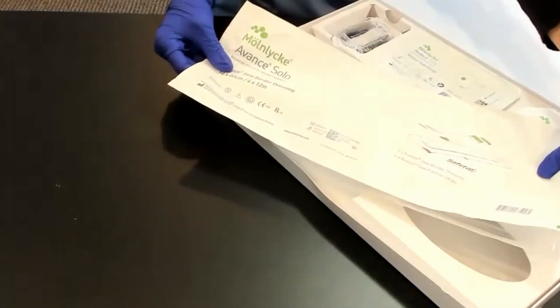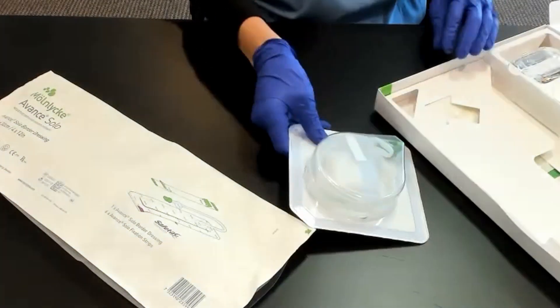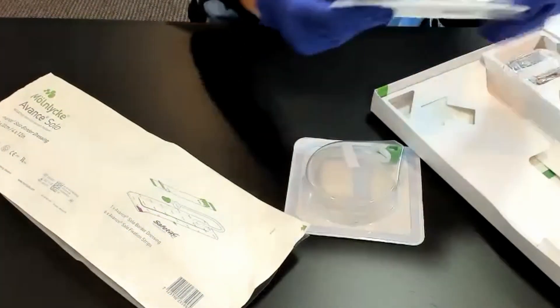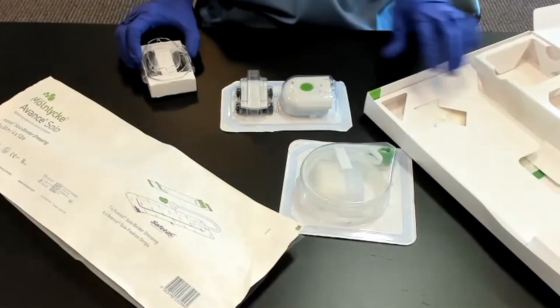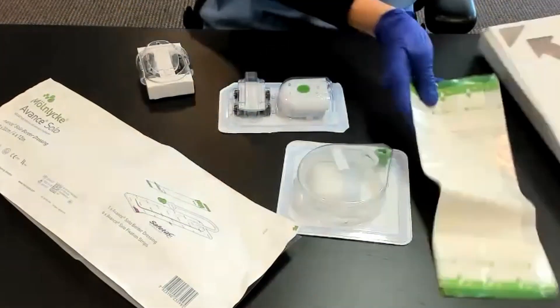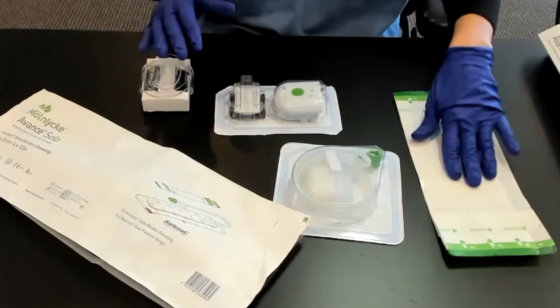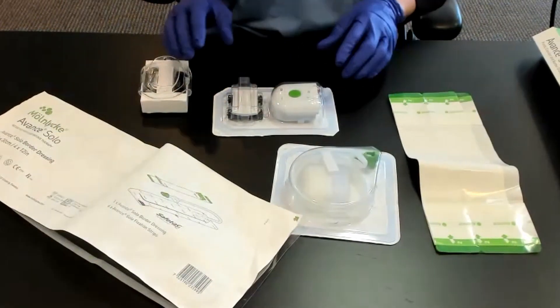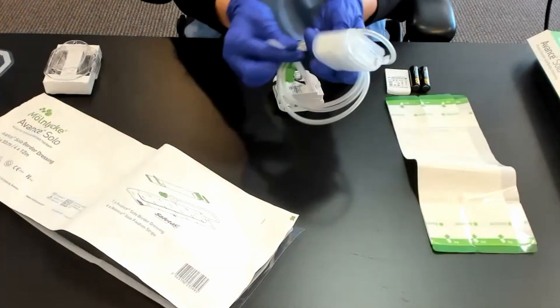This is the Molnlycke Avance Solo — it's an incision management dressing that comes in a kit with the dressing itself, a canister, the pump, a spare set of batteries, a belt clip for the pump, and some extra strips. All of this would be sterile when you get it in the operating room. We're going to open each one of these packets.